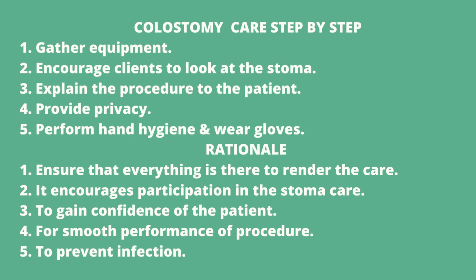Okay, so explain the procedure to the patient. If the patient is an adult, we need to explain to her or him. Okay, if the patient is a child, explain to her or his father or mother. Okay, provide privacy. पेशेंट को प्राइवेसी देना, इट्स वेरी वेरी इंपॉर्टेंट थिंग इन दैट प्रोसीजर. ओके, कोई प्रोसीजर कोई भी हो, if there is a necessity of privacy, we need to give privacy to that patient.